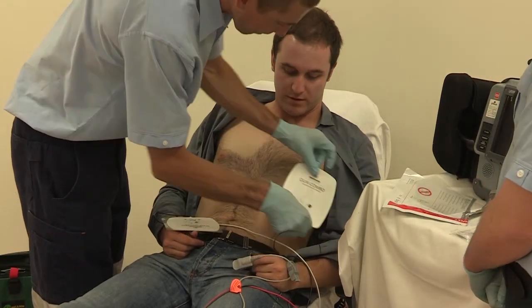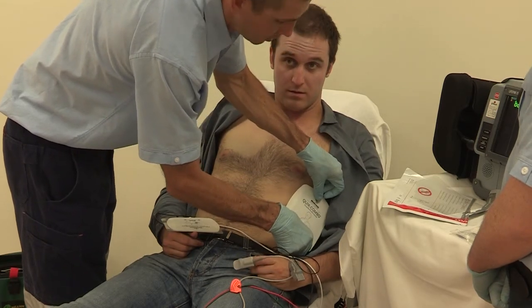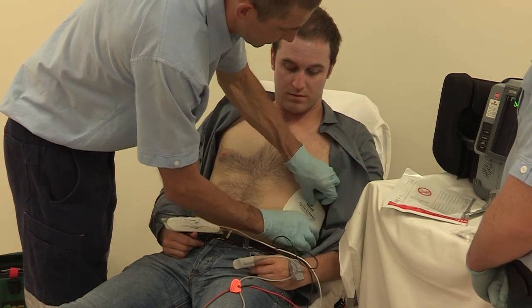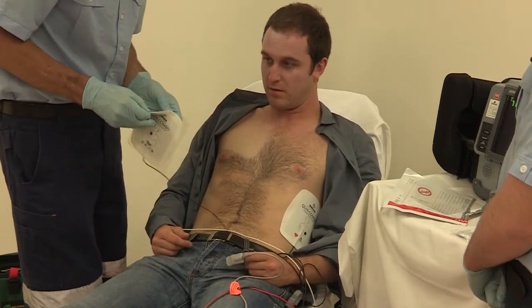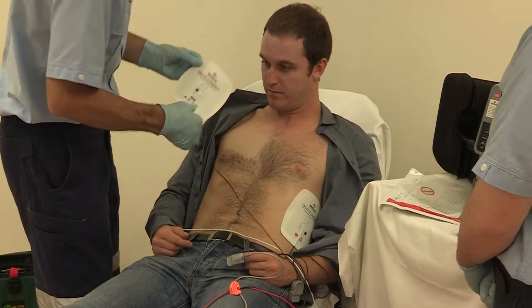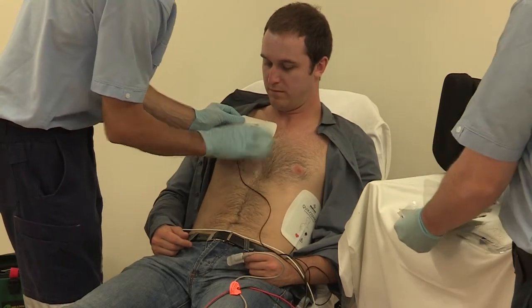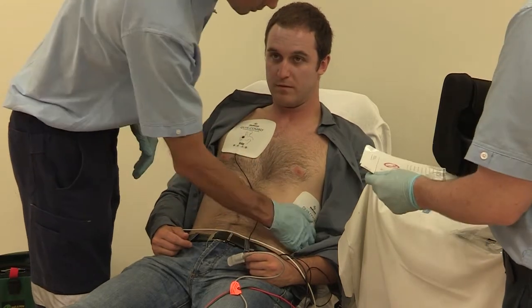This is one way of attaching the defibrillator pads to the anterior chest wall. Place the negative pad onto the right shoulder and the positive pad onto the left anterior chest wall, making sure that the pads are correctly adhered to the skin surface. If the patient has a lot of hair, you'll not get good adhesion to the skin. Shaving may be required.